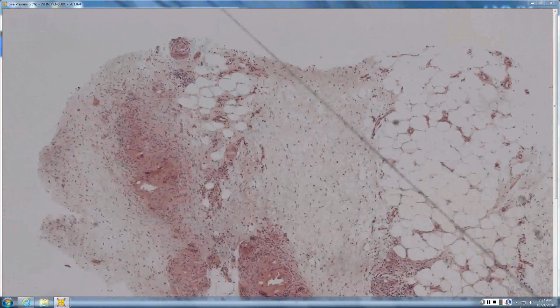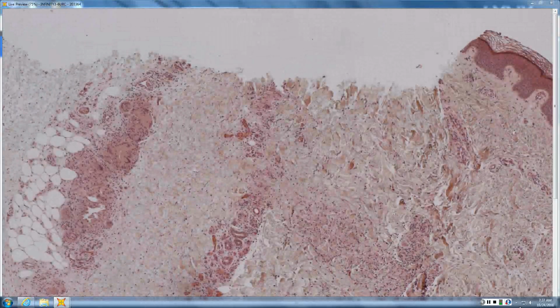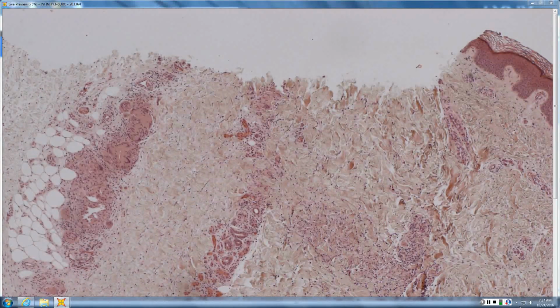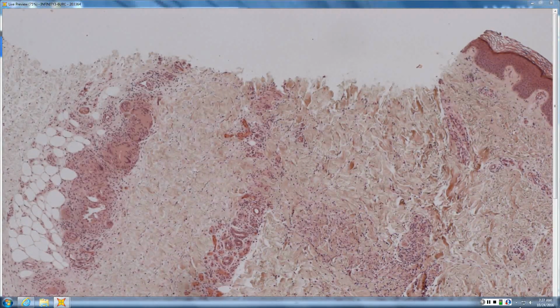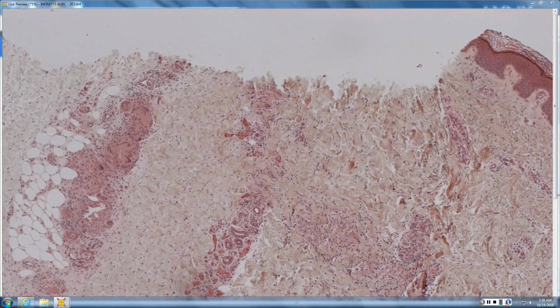So what things are you going to do with this case? Maybe slap a colloidal iron on there, since we have interstitial, and this did turn out to be granuloma annulare. The other thing is, if you didn't have the interstitial component, you might think of sarcoidosis. Again, giant cells, not so much in sarcoid. Those were the things that I was thinking about. Very good. And the other thing is there are granulomatous drug eruptions that could have been in the differential as well.